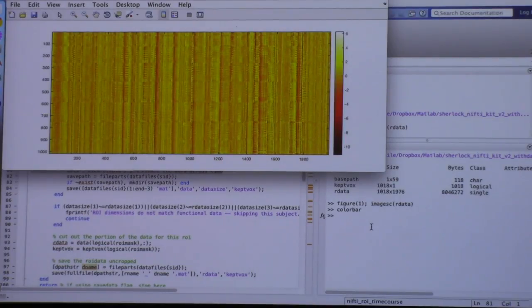And if you don't remove the global signal in fMRI, all the spatial locations share a signal, and so all the correlations are super high. These are temporal correlations. So what people do is they remove the global mean. You're averaging across space, across the whole brain, and you get an average time course. And then you subtract it out or you project it out.